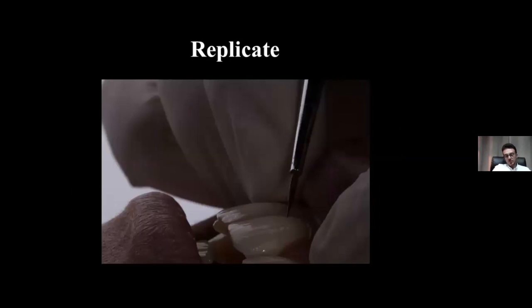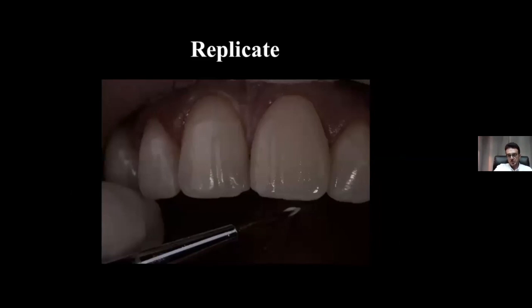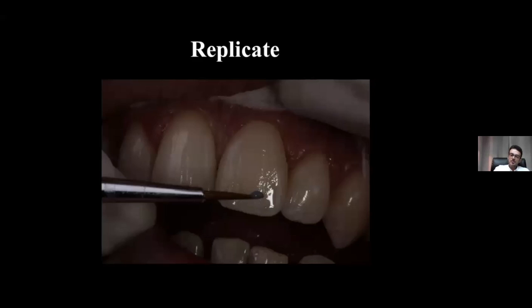After isolating, we will place just the refreshing liquid or the staining liquid that comes with the kit on the restoration, and then we start to draw our 6 color shapes if they exist in the adjacent teeth. So in this case, we had an incisal halo, a white incisal halo actually, and we had a bluish or opalescent effect in the translucent zones and the interproximal area.